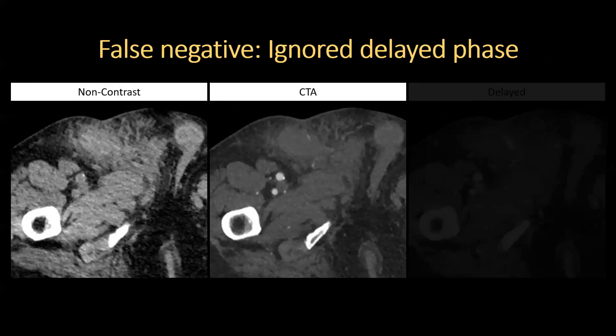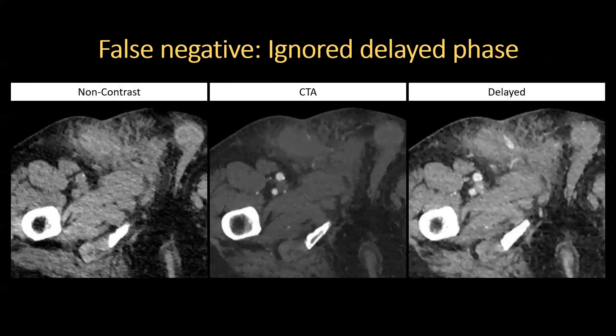This next case is a 70-year-old man with a groin hematoma following endovascular abdominal aortic aneurysm repair. Sometimes we focus on the arterial phase and ignore the delayed phase. In this case, the bleed is very subtle on the arterial phase. On the delayed phase, however, active bleeding into the groin hematoma is very obvious. Looking back at the CTA, the subtle focus of contrast extravasation could be mistaken for a traversing blood vessel. I can't stress enough the importance of looking at all of your phases.